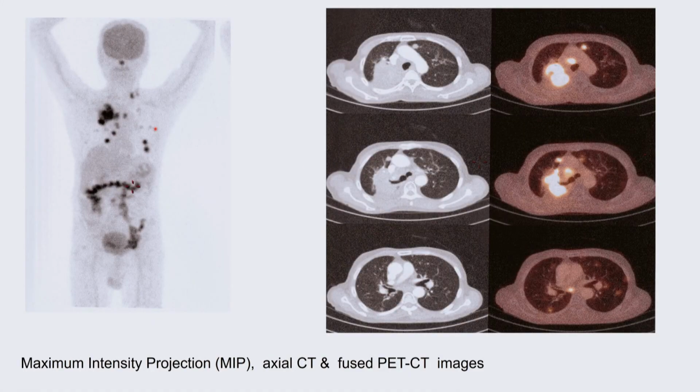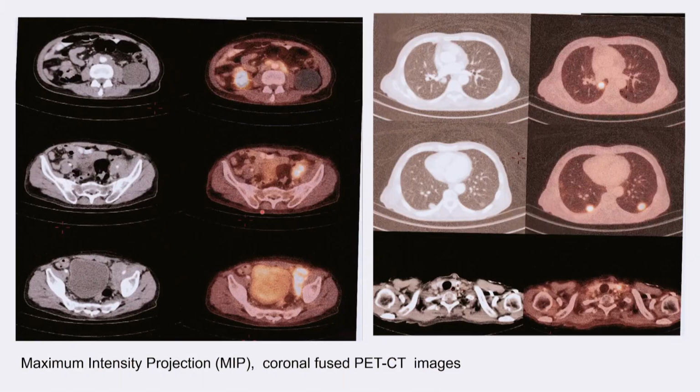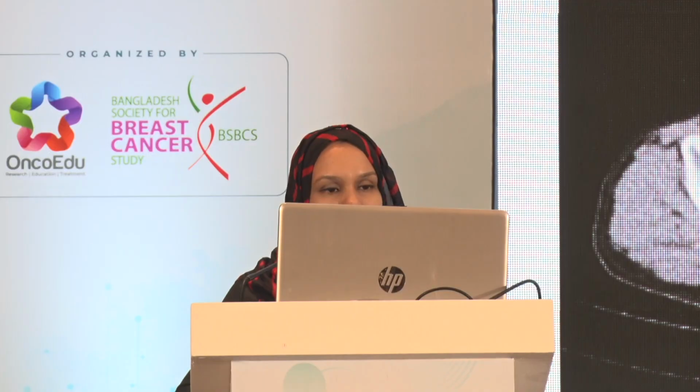This patient showed stable disease locally, but developed multiple nodal disease, multiple skeletal lesions, and also a new lesion in the medulla oblongata region, multiple abdominal lymphadenopathy, and also a lesion in the spinal cord region. And this patient expired 15 days after his second PET-CT scan.